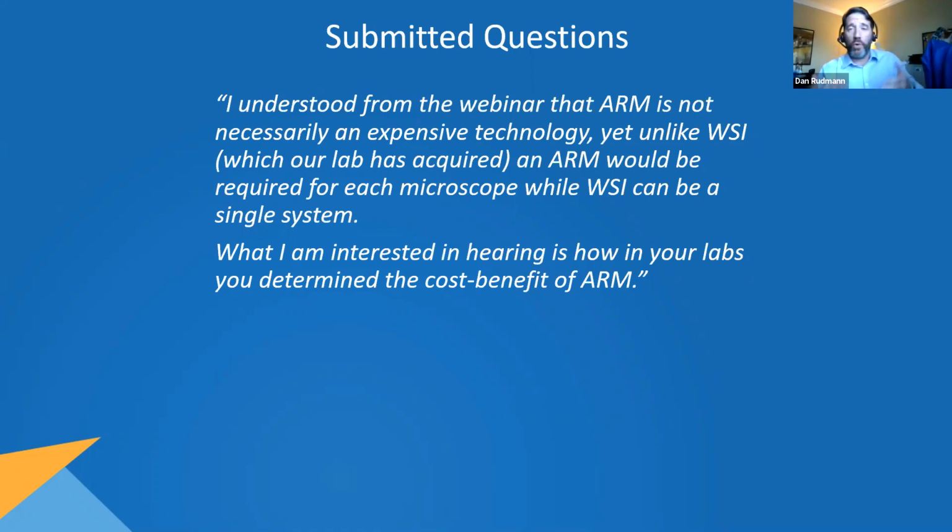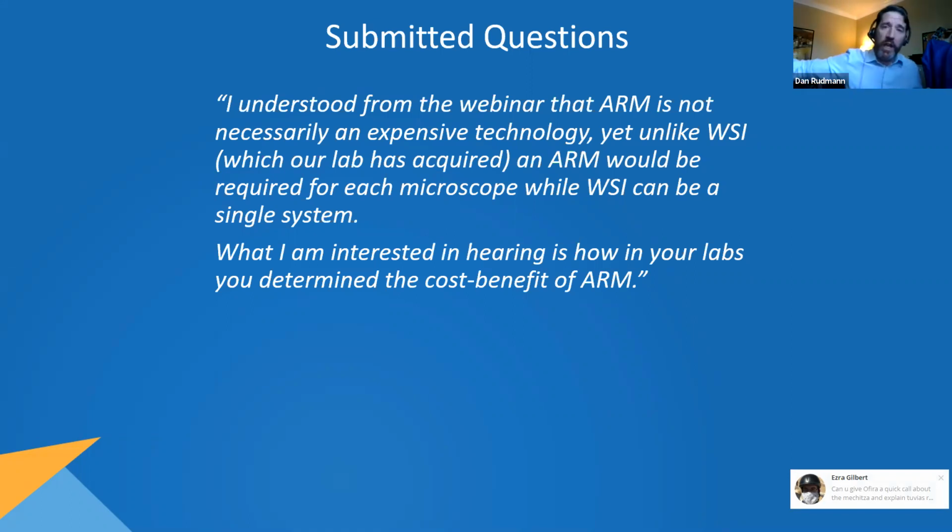Or do you want to make it more ARM focused, where the pathologist chooses what to apply the ARM to? And so you save all that overhead of scanning and everything, and the slide comes right out of the lab, it goes on the microscope with the pathologist, and the pathologist has a toolkit of AI algorithms that he or she can apply on the microscope.